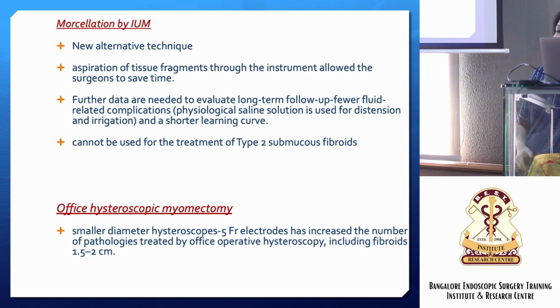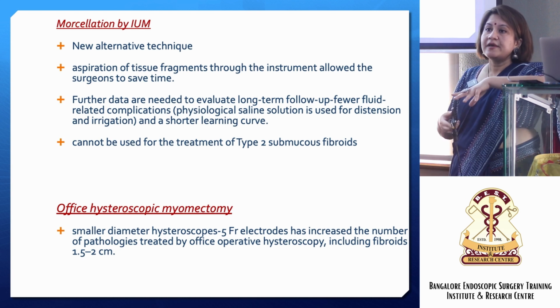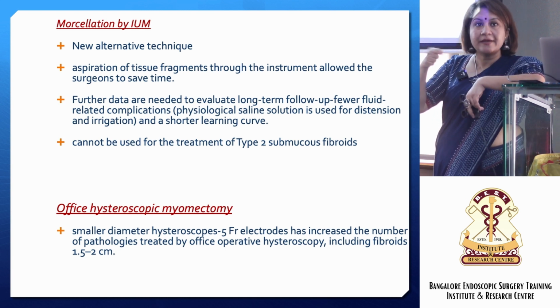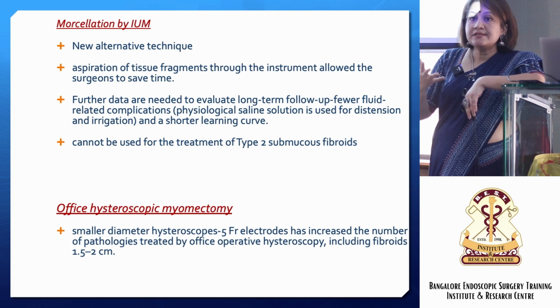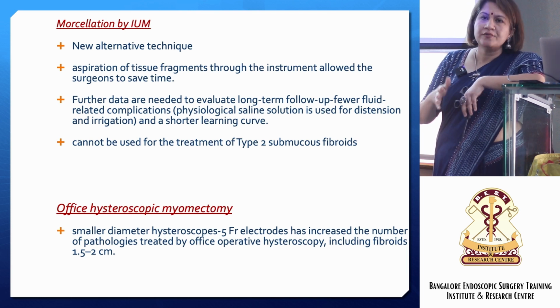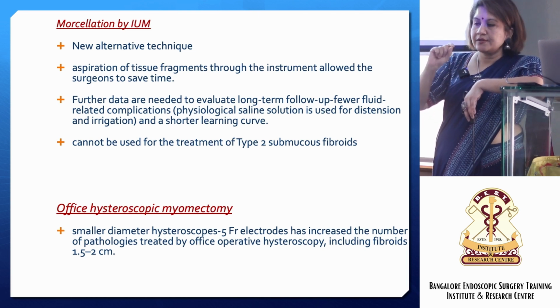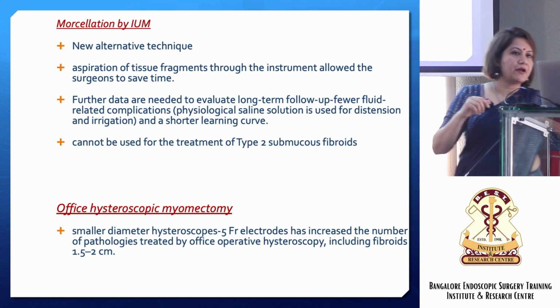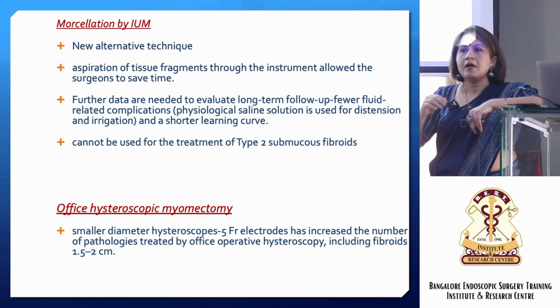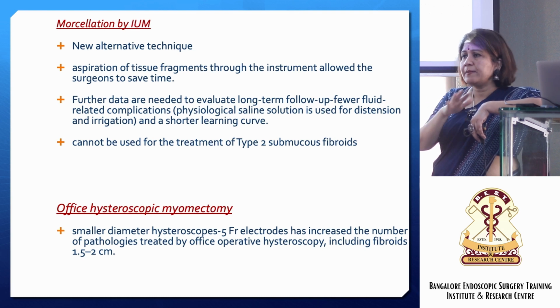Now the other new thing that has come, which I'm also waiting to see how it evolves, and which makes a lot of practical sense, is the mechanical morcellator. The whole system itself is very expensive. Last I knew it was around 25 lakhs. It's a very nice instrument otherwise. I don't know whether I have the video here because some videos went off, but if you Google, it is there. And I've seen Dr. Vidya also demonstrating it in conferences.